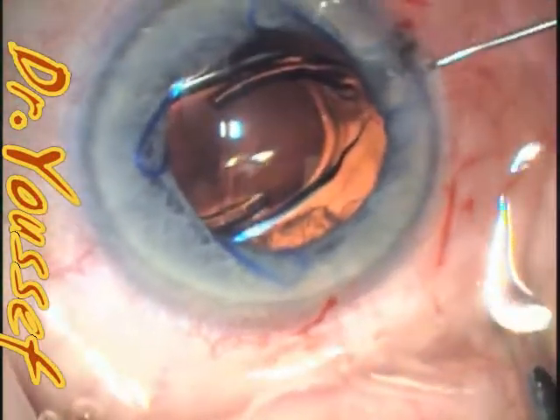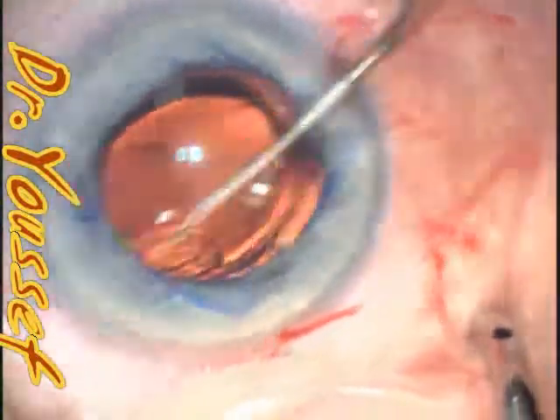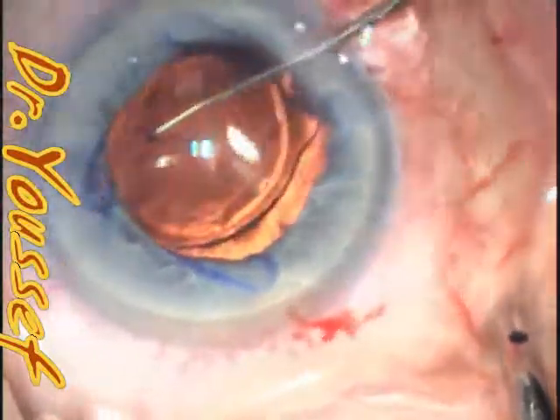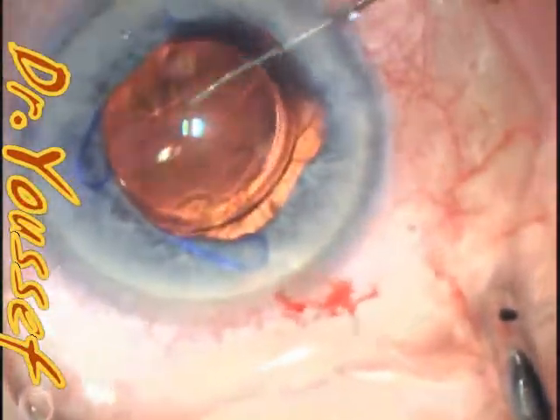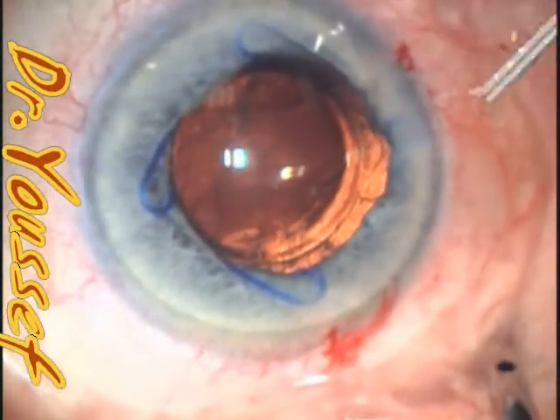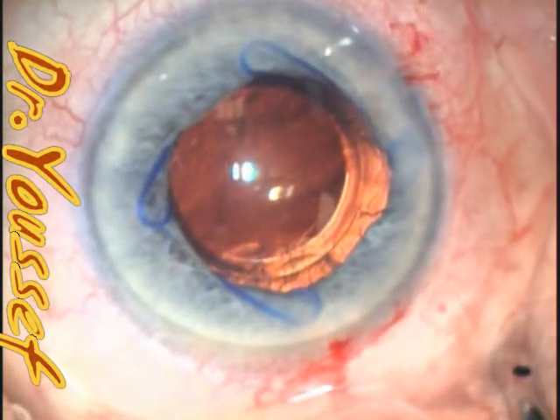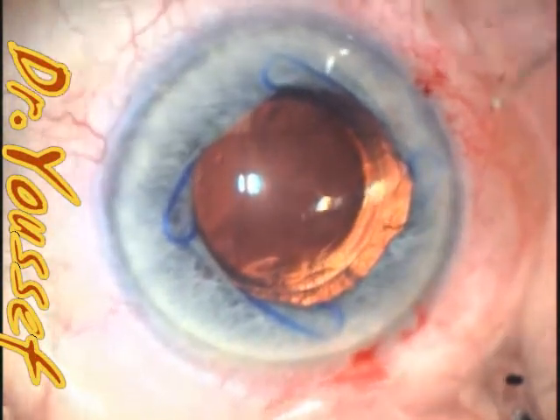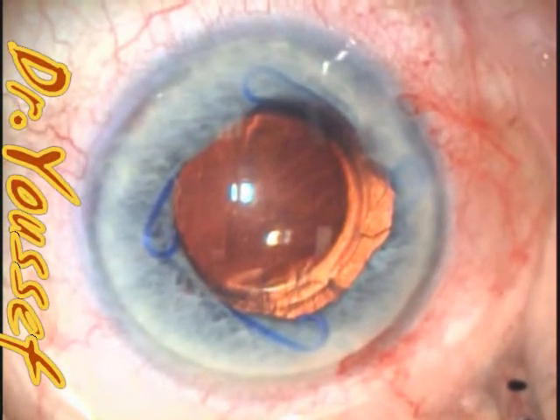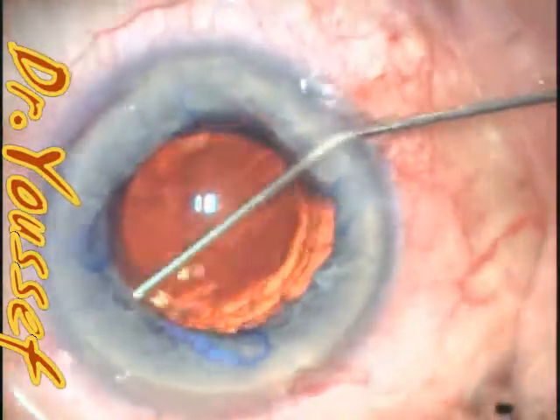and I try to keep the haptic in the direction of the small dialysis that resulted. So this way it will be in a good position. And try to decrease the manipulation as much as you can at this stage, so that you don't drag more vitreous to the front. So far I don't see any vitreous, so it's doing well.